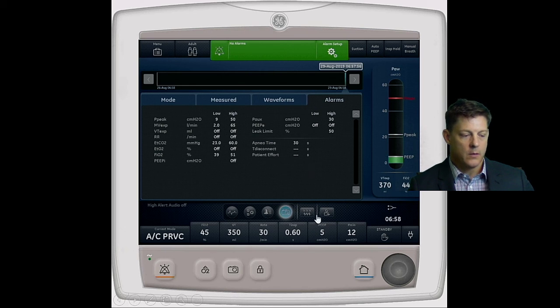Next, what I want to do is I'm going to go to the far right over here in this workspace. So when I click this, it's going to close the past, and we're going to go to the future. So I'm going to jump to the future.